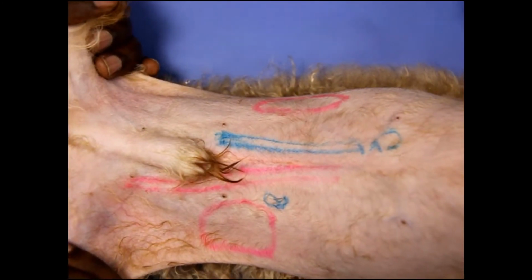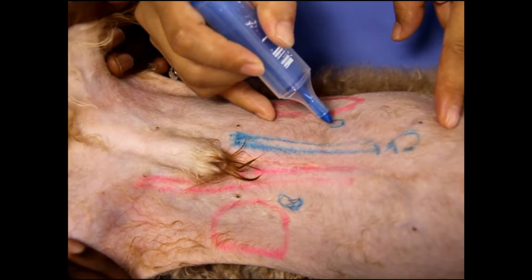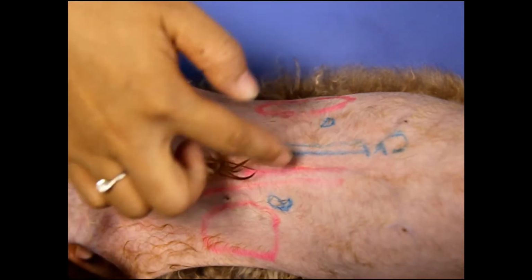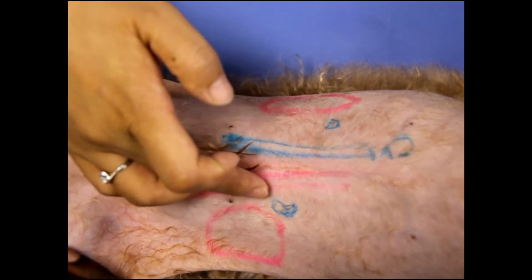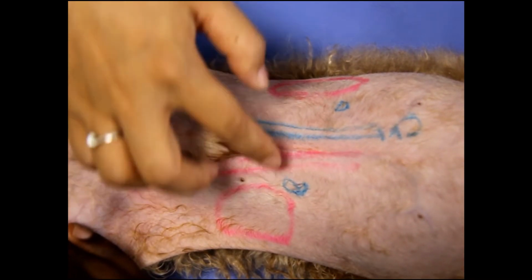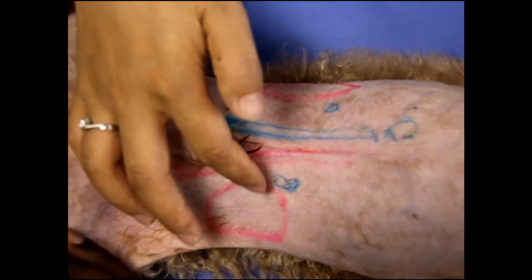And the right one is something like this here. You can see the shapes are a little bit different for dogs. The left adrenal gland is something like a peanut, and the right is like a comma, so they're different. But for cats, both sides are a little bit similar.